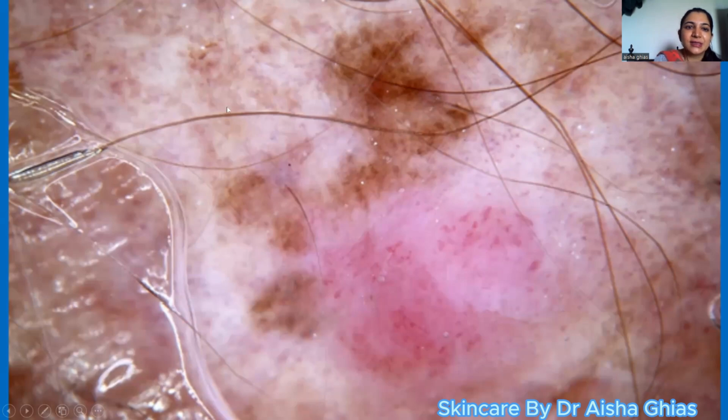But this thing is skin color, so we will disregard it. You do not take skin color into consideration. The color which is lighter than that of the skin is taken into consideration, like over here and over here. This is whiter, a little lighter in color than the skin. So this is an eccentric structureless area. You see structureless areas in nevi as well, but they are symmetrical.